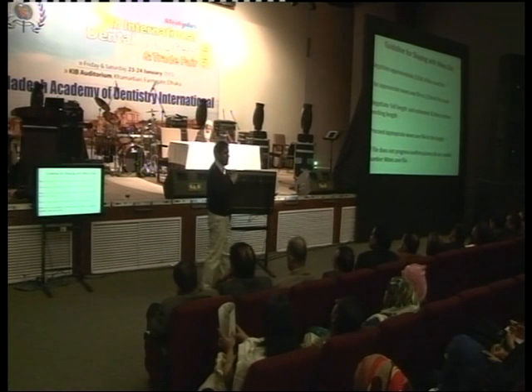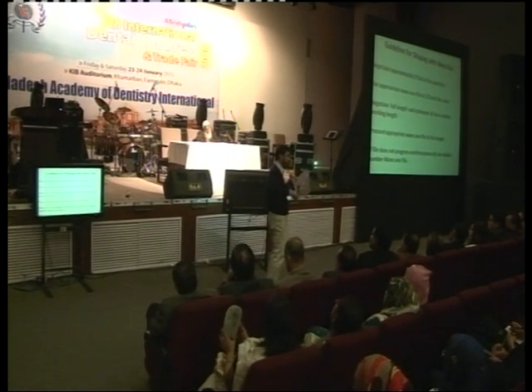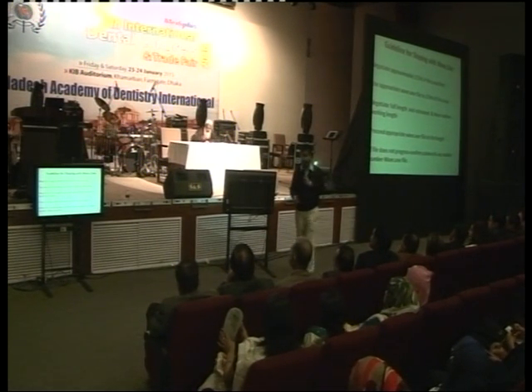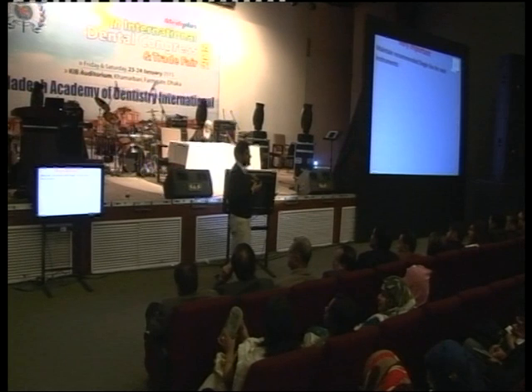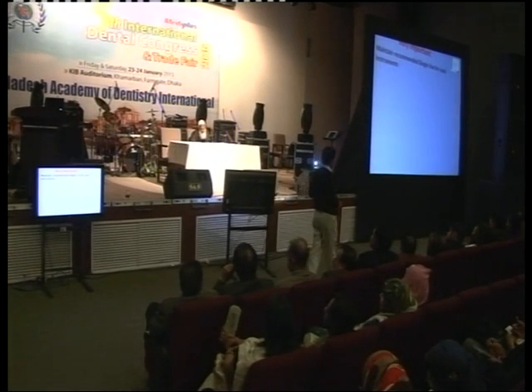If you use the Wave One file 3, 4, or 5 times, then 5 times you will have to negotiate it. You will have to break the cutting dentine or materials inside the canal. You have to remove it, irrigate it properly. Then there will be no chance of fracture of the instrument. You must maintain it. If you want to use it in 2 or 3 canals, then there is a chance of fracture of the instrument. It will definitely fracture.